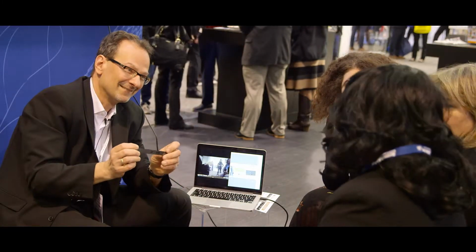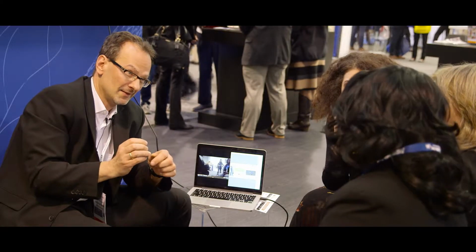Is it 10,000 cycles? Is it 20,000 cycles? So if it's designed right, it should stay for 400 million cycles, because this is the minimum, 400 million. Because this is kind of 10 years. So implants are typically set up for 10 years. Yeah. So that's a 10-year cycle.